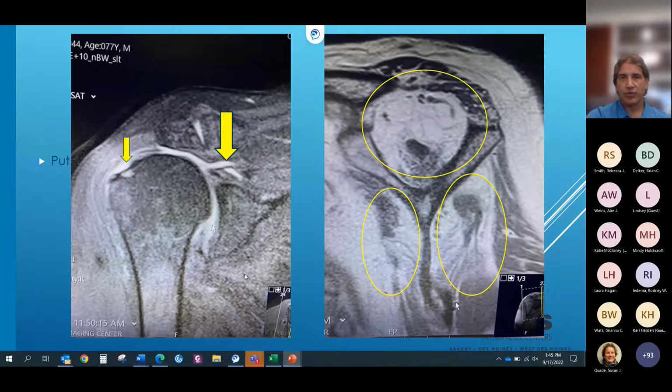Because this is not a fixable shoulder, even if you just showed me this one picture of the supraspinatus. If there's more than 50% atrophy in this space, so more than 50% is white compared to dark, then it probably is not going to be a successful repair. And this is really bad. That just happens with disuse usually. So you tear it and now it's not attached to anything. Over 5 or 10 years, when this person neglected it, it just turns to mush.